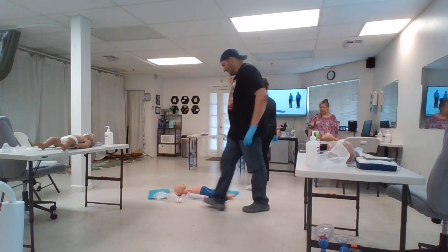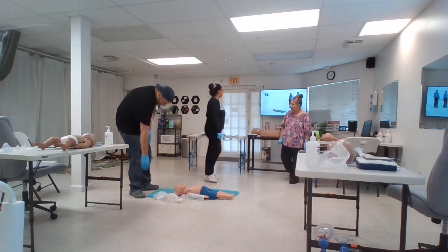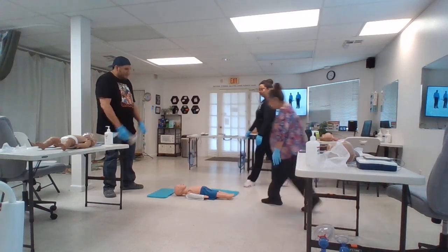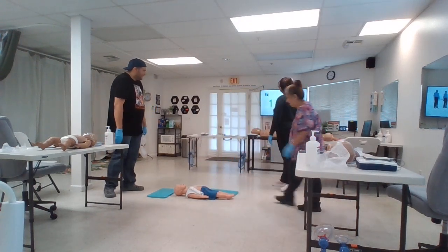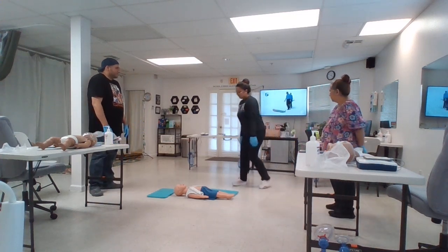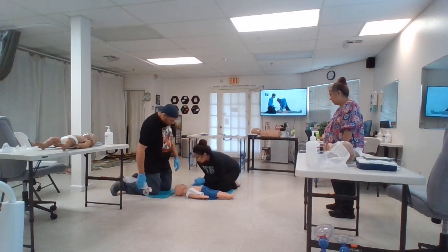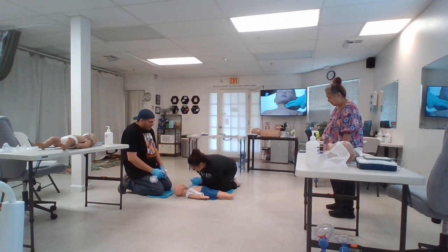So let's count down to compressions and get started with 2 rescuer CPR for children, starting with scene assessment. To stay together, follow the prompts on the screen. Let's go in 3, 2, 1. Hey, are you okay? Hey, are you okay? Activate the emergency response and get an AED.